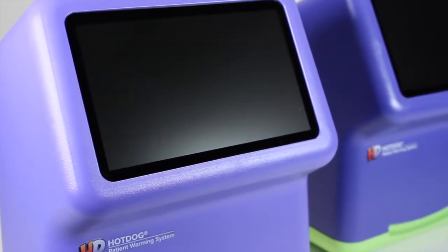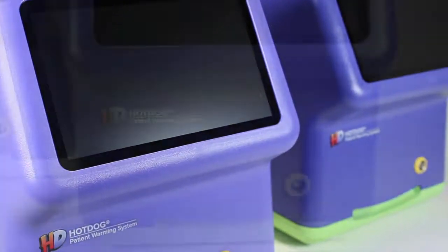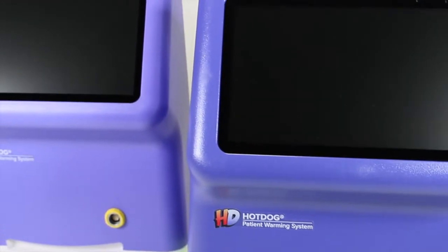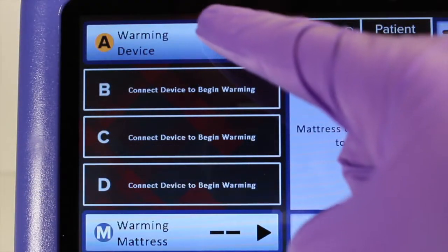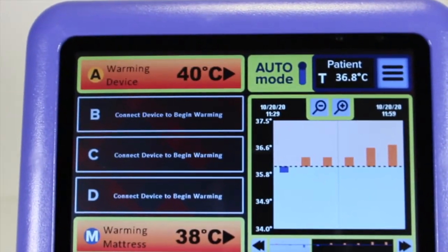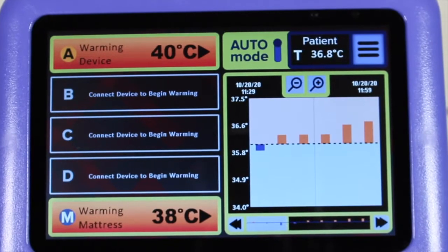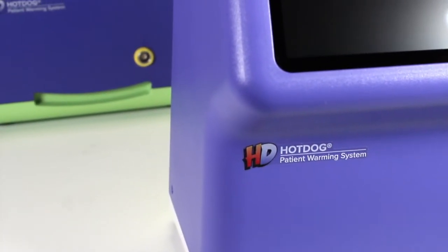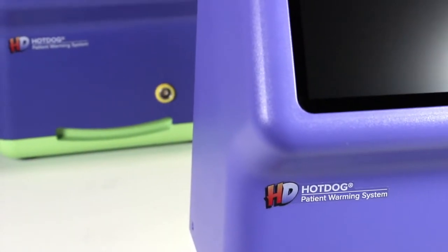The all-new WC7X Hot Dog Temperature Management controllers provide a significant leap in functionality and user experience. The aesthetics, touch screen interface, communication features, data feedback, and versatility are all designed to benefit the clinician and patient. The WC7X controller has two model variants.